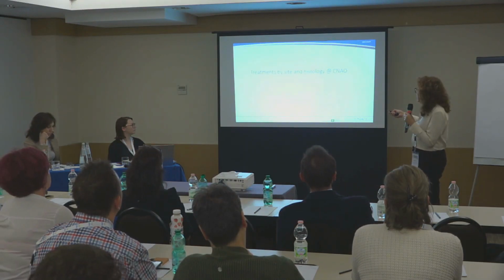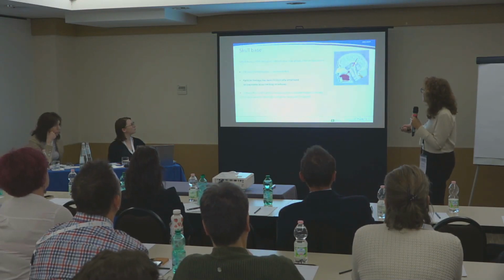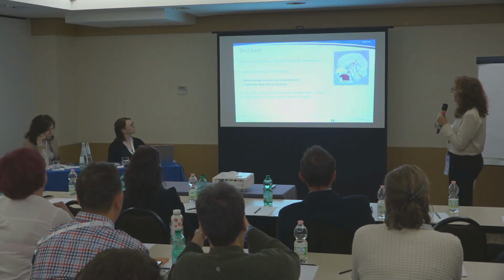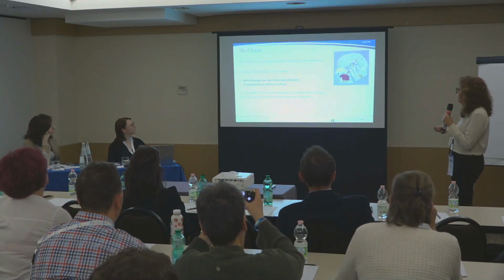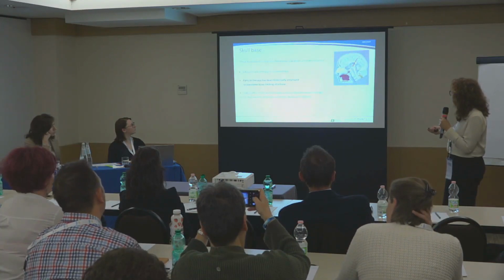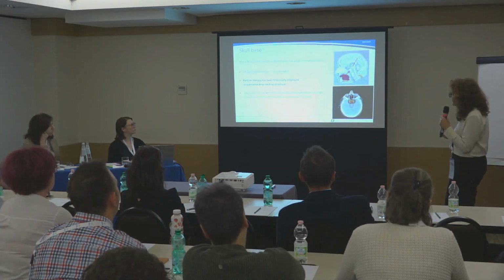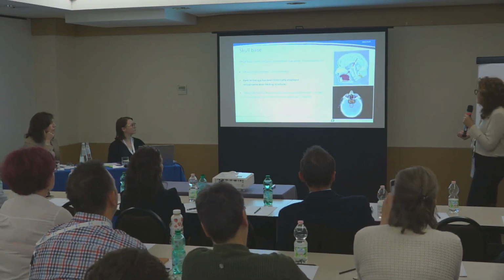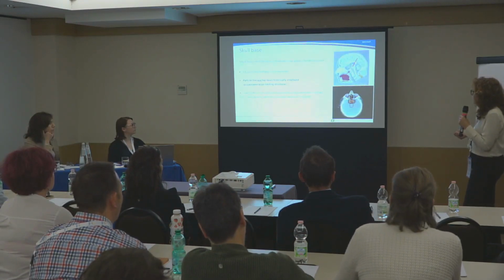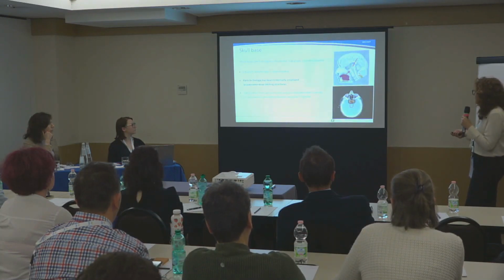So these are examples of treatment by site. In skull base, the most frequent histologies are chordoma and low-grade chondrosarcoma. Historically, adjuvant radiotherapy is recommended, and particle therapy has been used because in this region we need the physical selectivity of protons or carbon ions to spare the organs at risk very close to the tumor, optic pathway or brainstem, so very important organs.